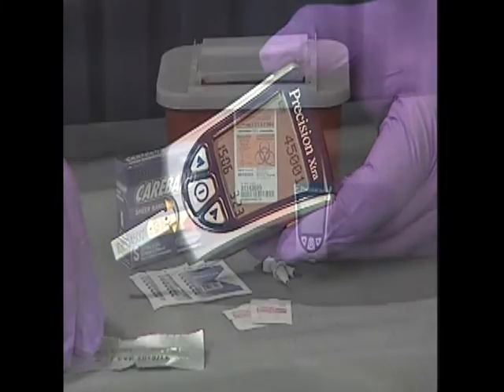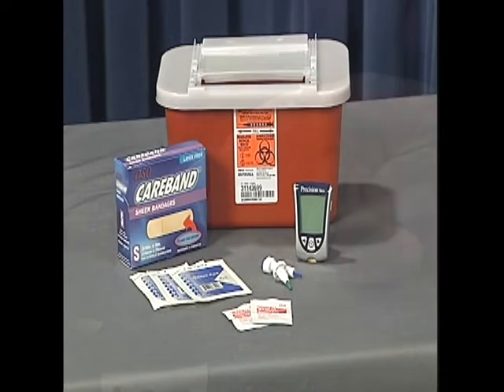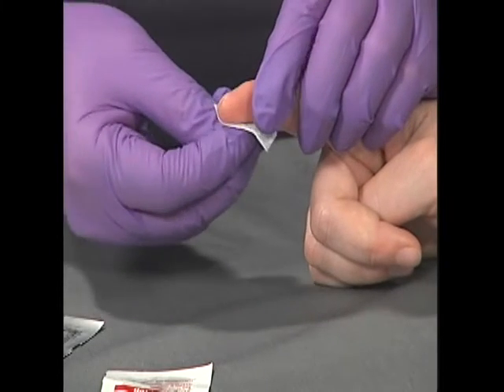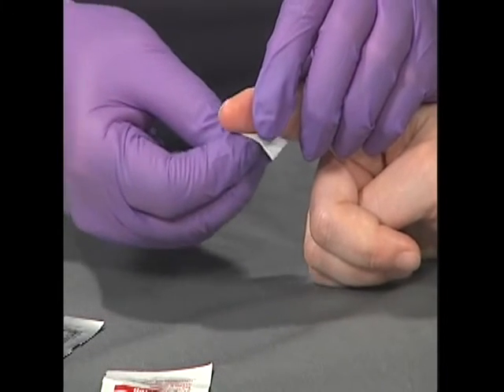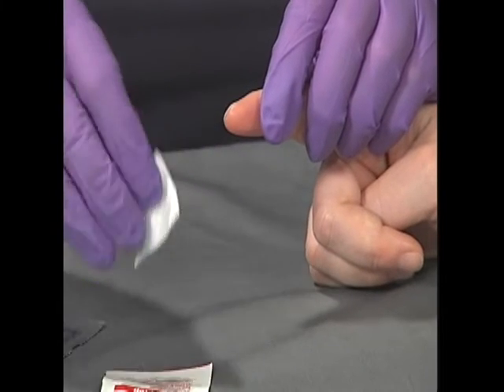When performing the skill, prepare all the necessary equipment including the glucometer, lancet devices, alcohol wipes, sharps container, and band-aids in advance. Make sure to clean the finger with an alcohol prep pad, allowing the area to dry for approximately 30 seconds as you continue to keep that area of the finger clean.